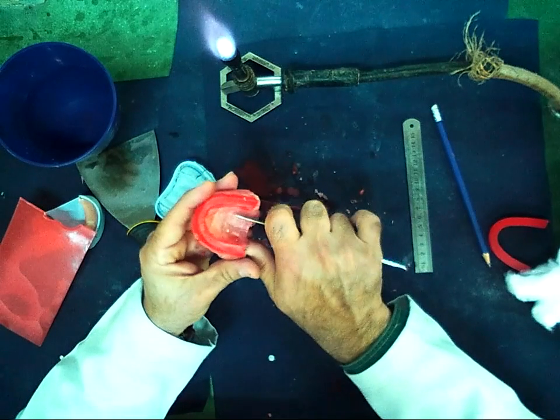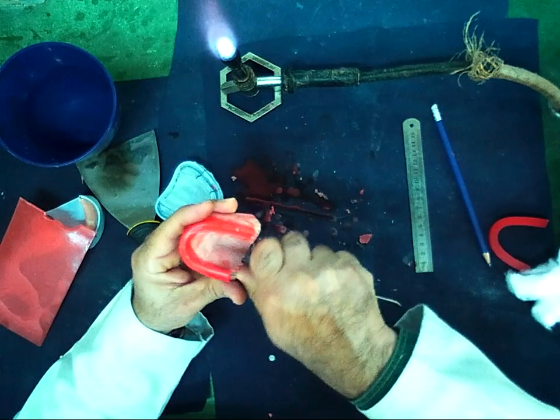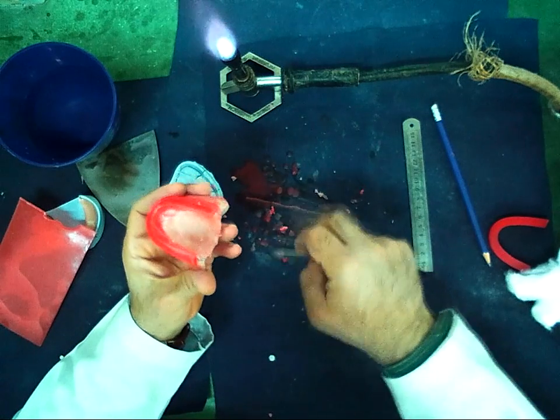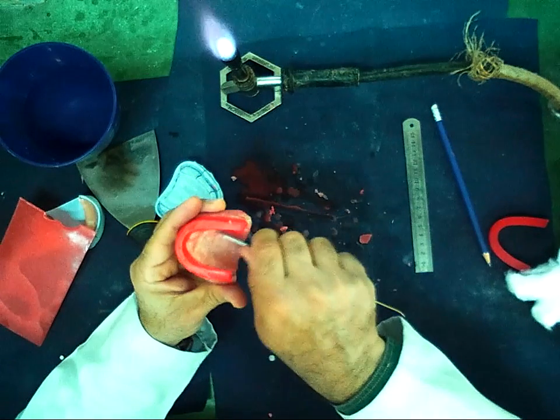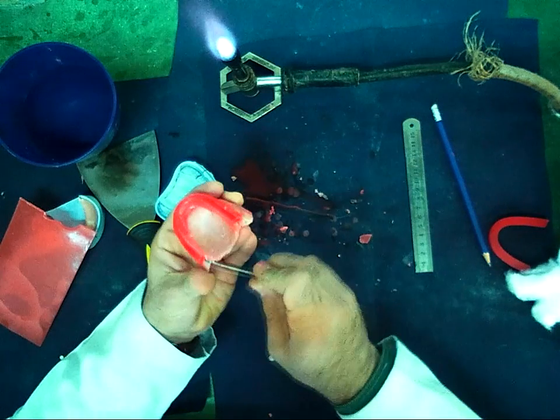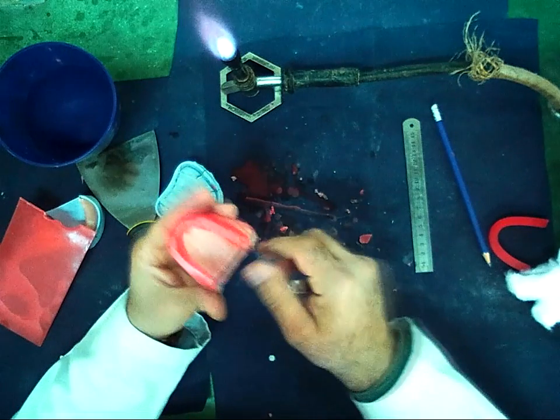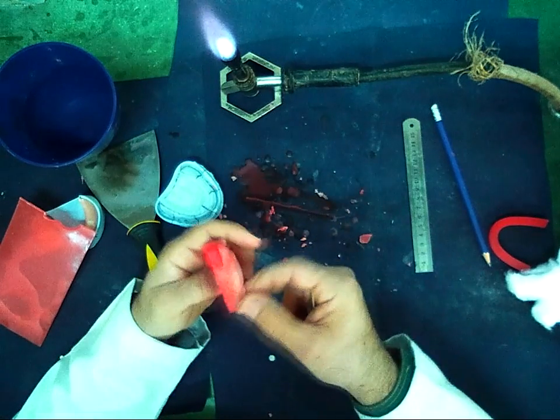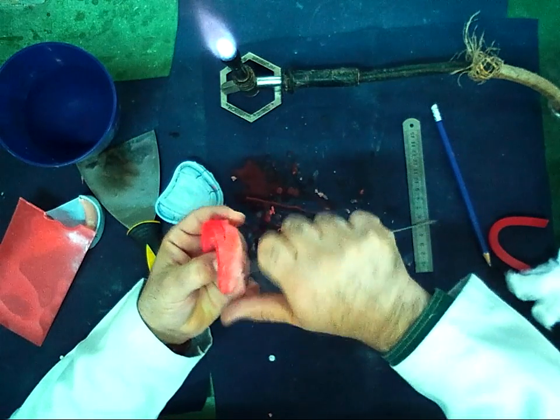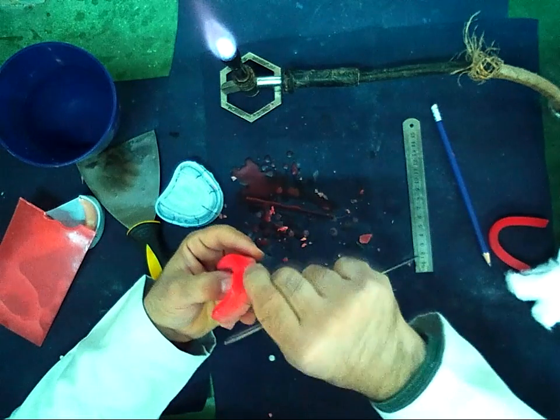Any excess wax on the palatal side, I should remove it. Any excess material on the flanges, I should remove it. Any part without wax, I should add wax to it.